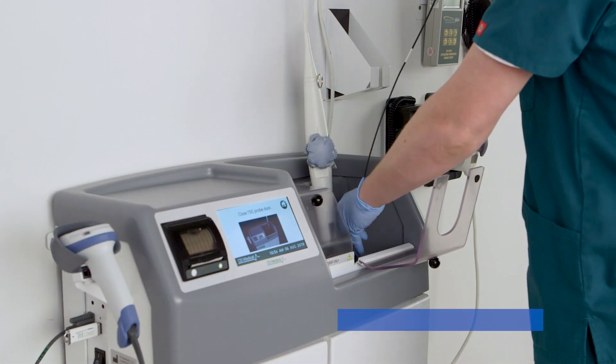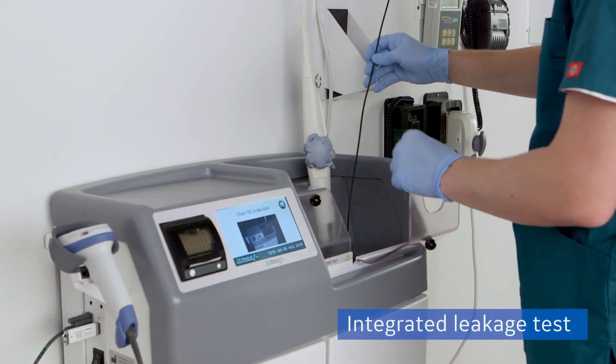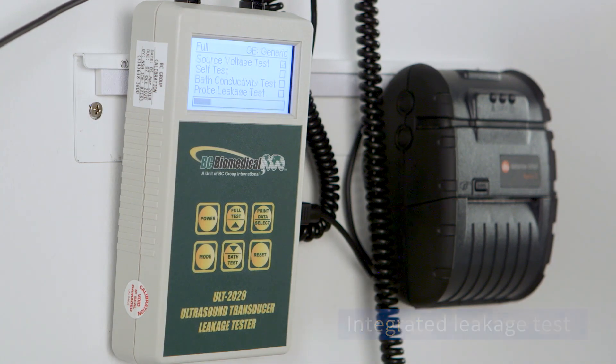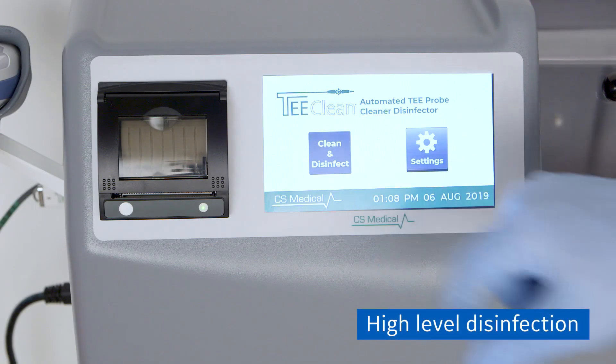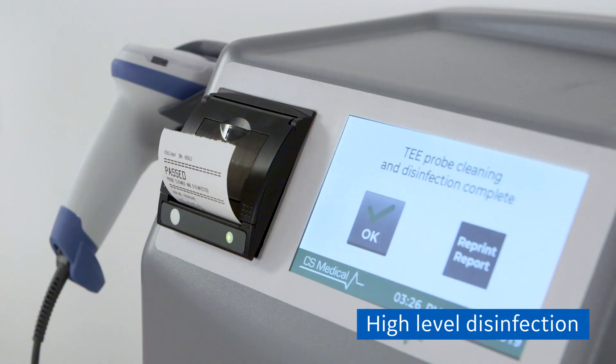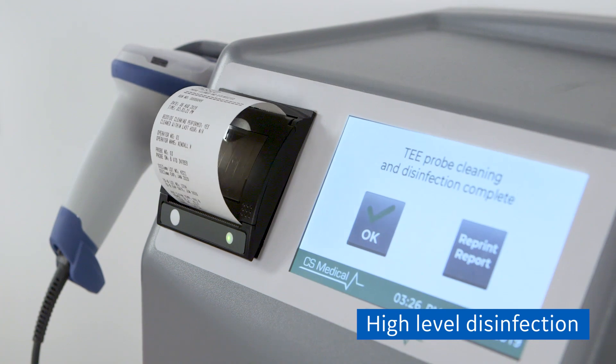Once the probe is inserted into the T-Clean, the required electrical leakage test can be performed in seconds, offering an efficient method of testing. After the cleaning cycle is complete, the system performs two rinses, then the disinfection cycle will begin. The printer provides a record of testing results.